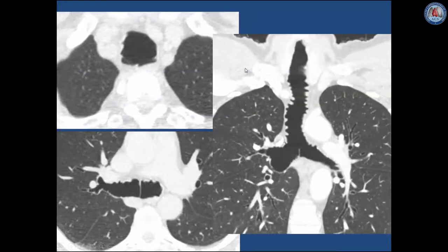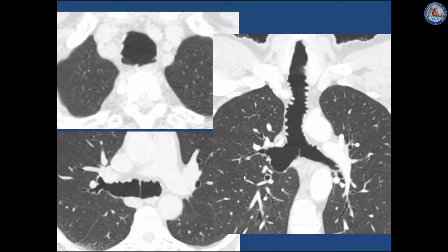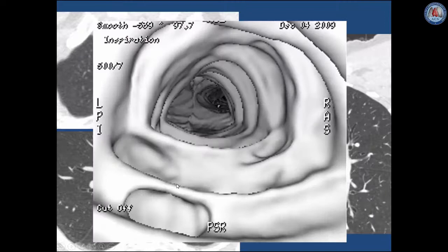In another patient with Munir-Kuhn syndrome, one can see the typical corrugated appearance and diffuse dilatation of the trachea and main bronchi on coronal and axial views. On the virtual bronchoscopic image looking from the proximal trachea towards the carina, one can see the diverticula protruding between the cartilaginous rings and the diffuse dilatation of the trachea.